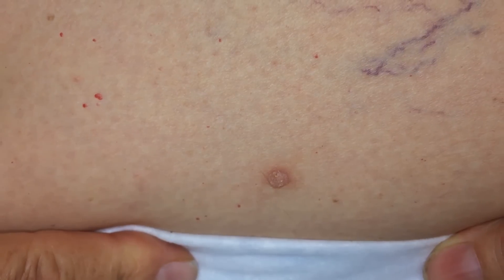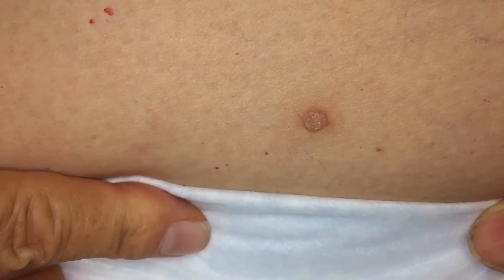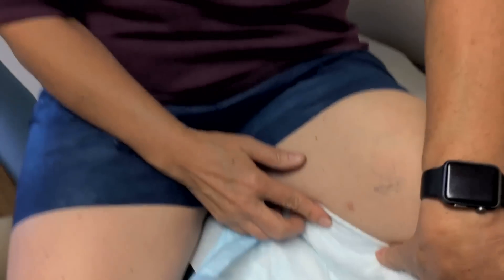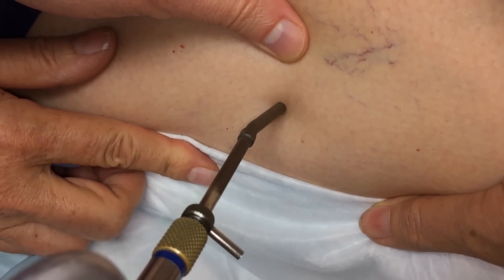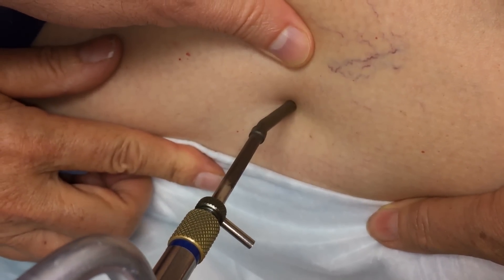A lot of you may remember Joellen had this done a month ago — freezing of the wart — and we checked after a month to see what kind of progress we got. You can see that this one is needing a little bit more work, so we'll go ahead and hit it again with two freeze-thaw cycles of about 20 seconds each. All right, so you came back. We'll do more and push up this way. Put it right on before I start spraying — keep slipping — so I want to make sure it's gonna stay where we put it. Okay, here we go.